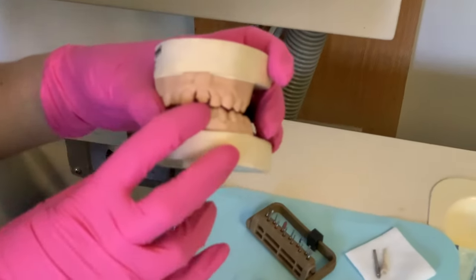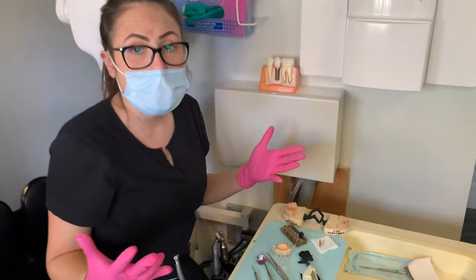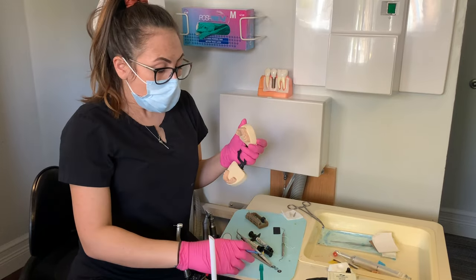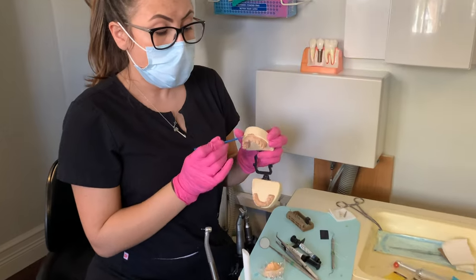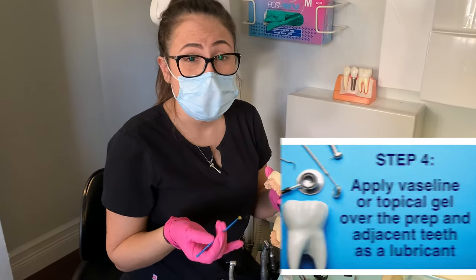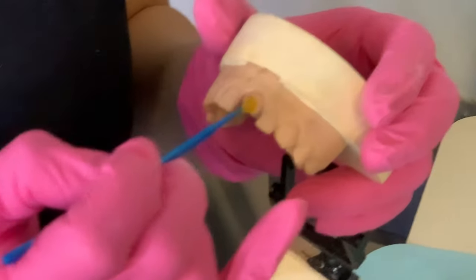This is what the tooth would look like if it was prepped — we're going to use that to make our temporary. But of course, if you had a patient, you would just do it directly in the patient's mouth. A few tips: on the prep, if you are scared that your temporary is going to lock, you can use either Vaseline or I like to use topical, because topical is easier to clean than Vaseline. So you get a little bit of topical on a micro brush and you put it on your prep.